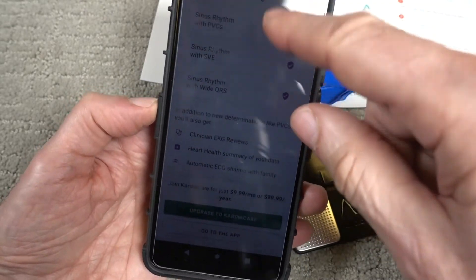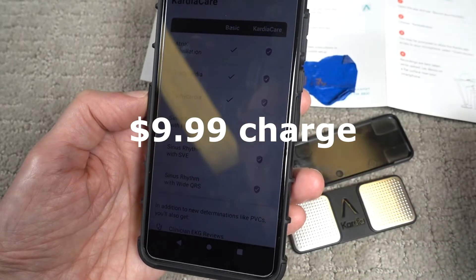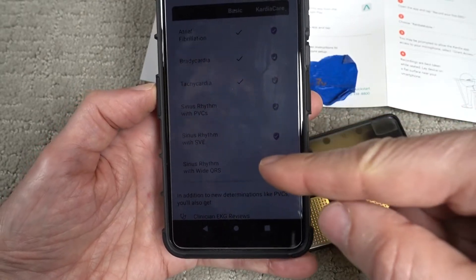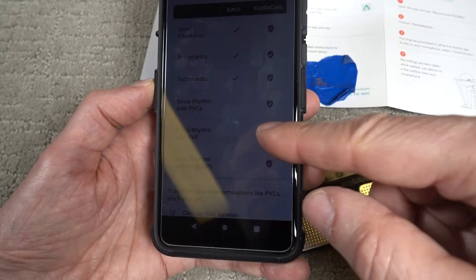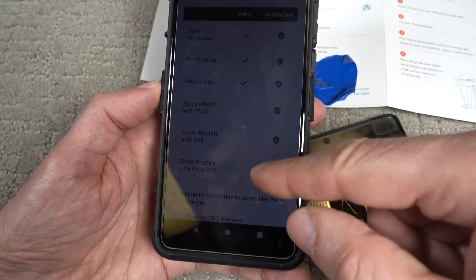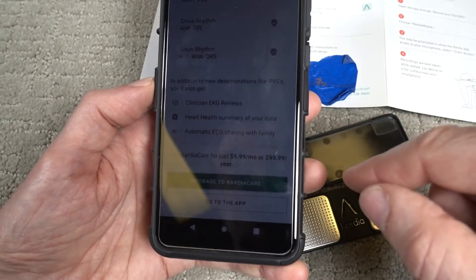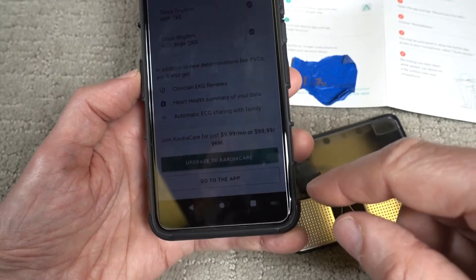Here's the deal — you probably can't read this, but with the basic $5 service you get three readings: atrial fibrillation, bradycardia, and tachycardia. If you want to add sinus rhythm with PVCs, sinus rhythm with SVE, and sinus rhythm with wide QRS — whatever those mean — you have to upgrade to something called KardiaCare, which is the premium, and that costs $9.99 a month.